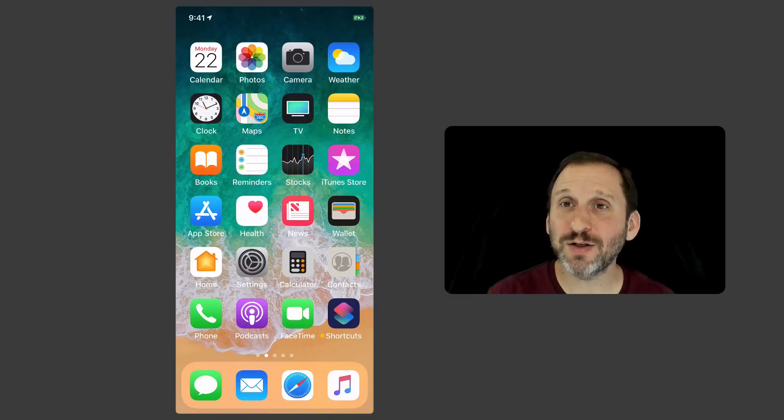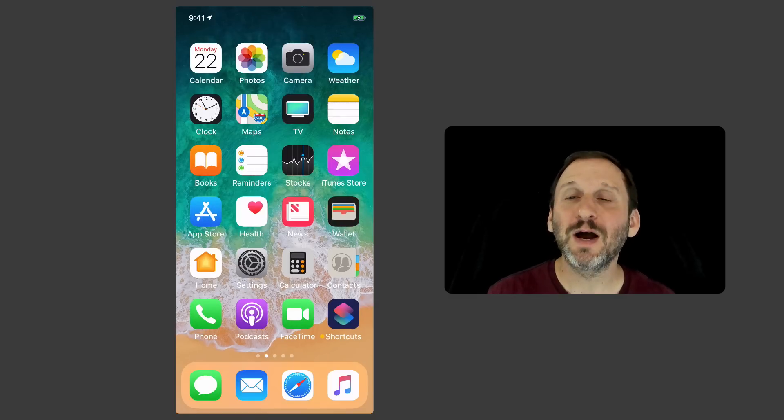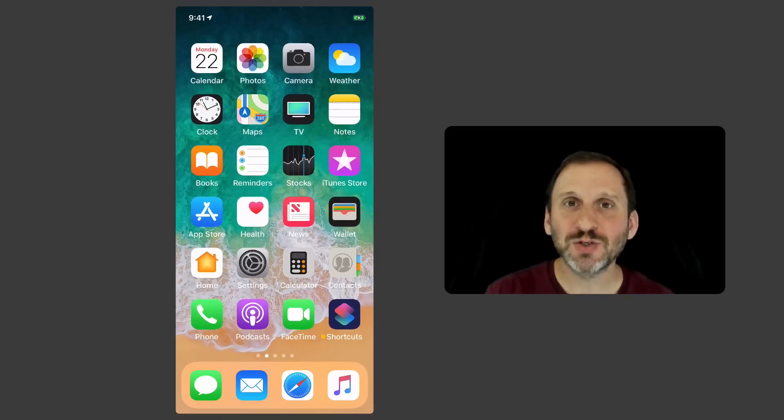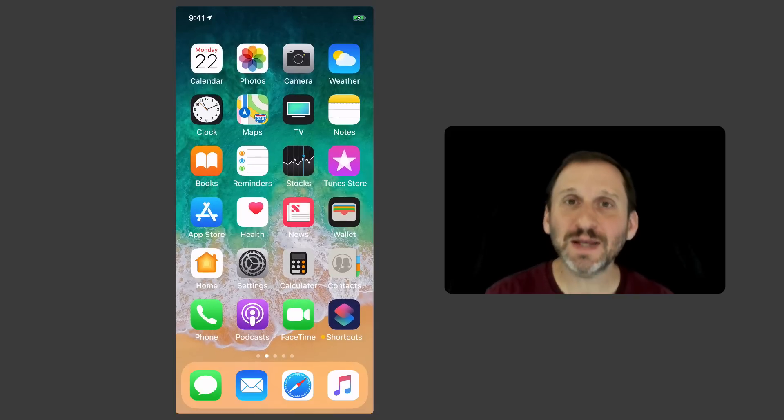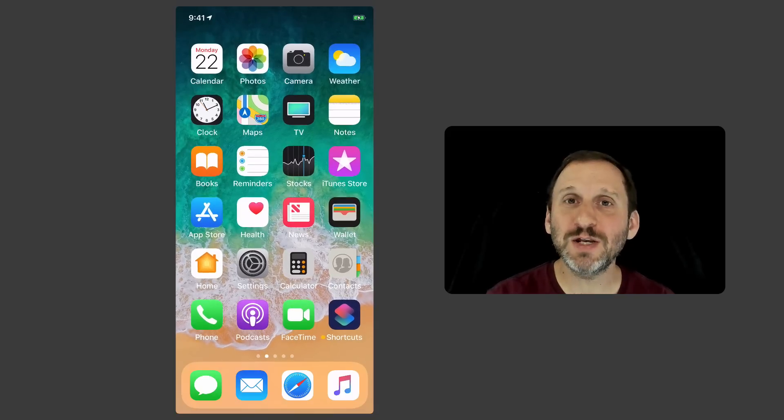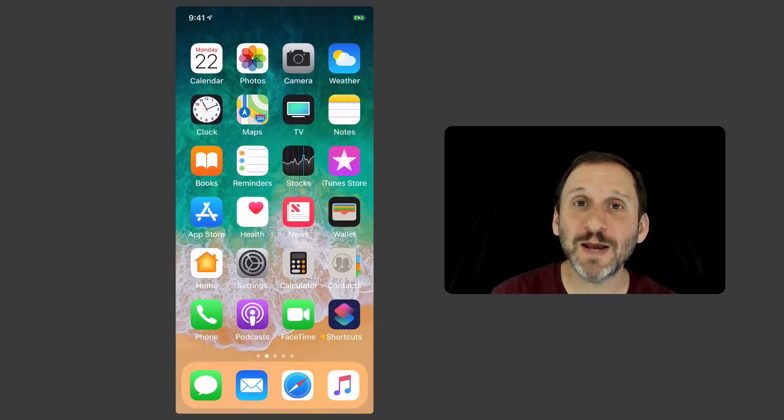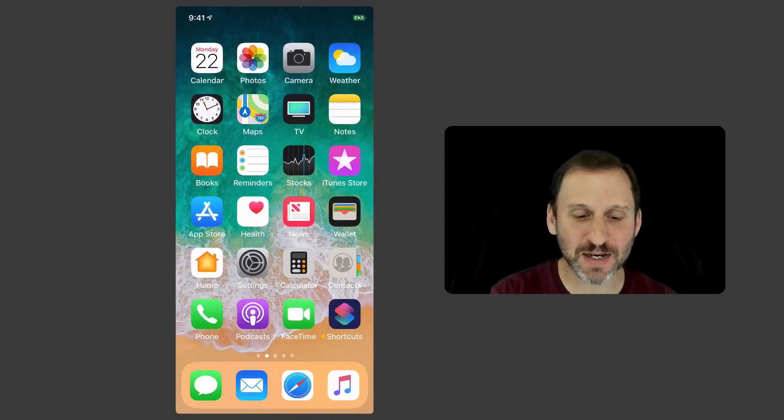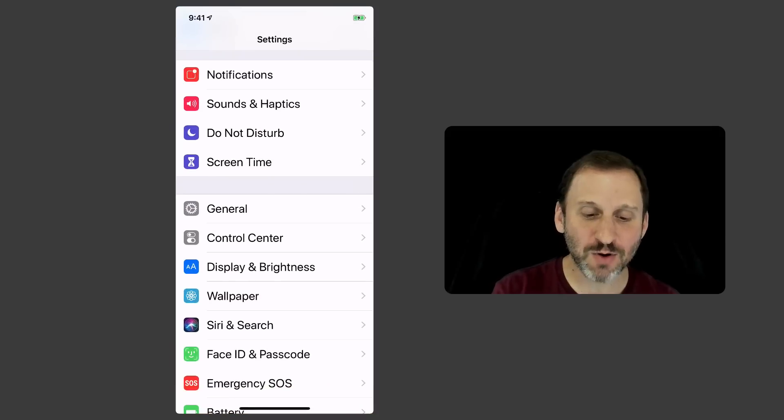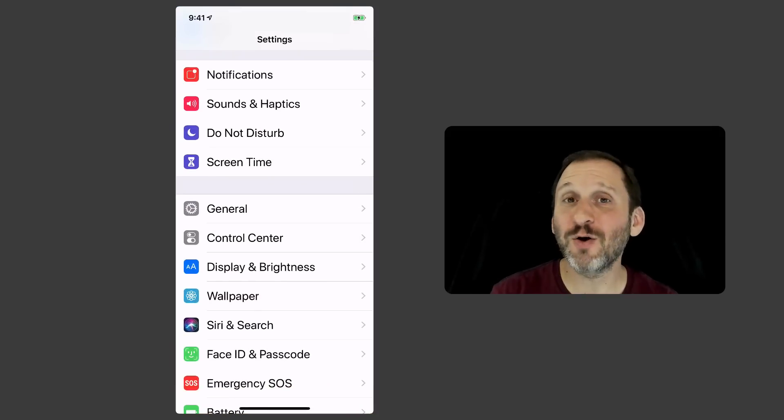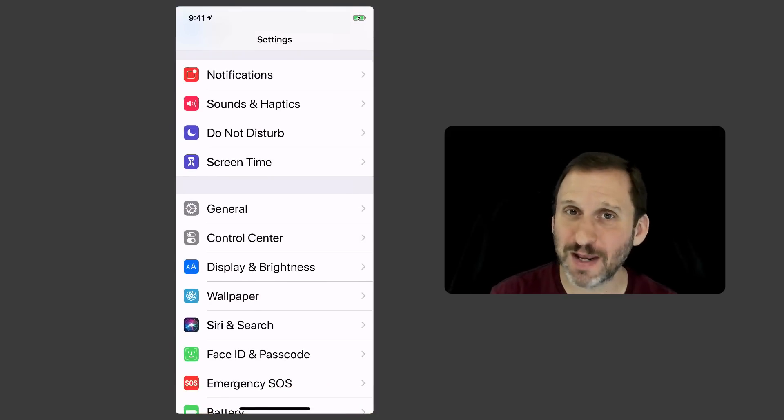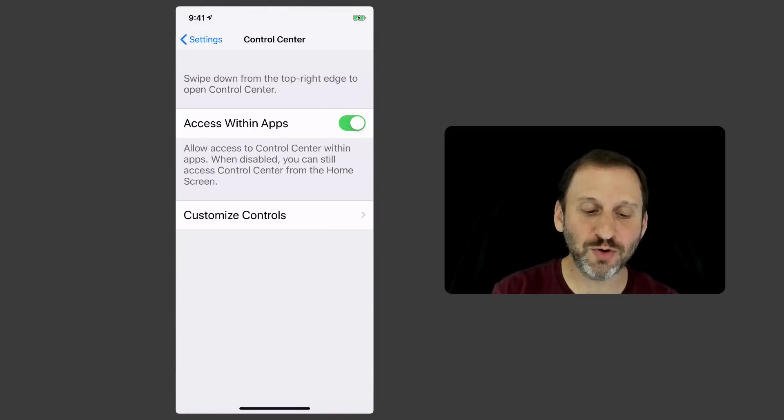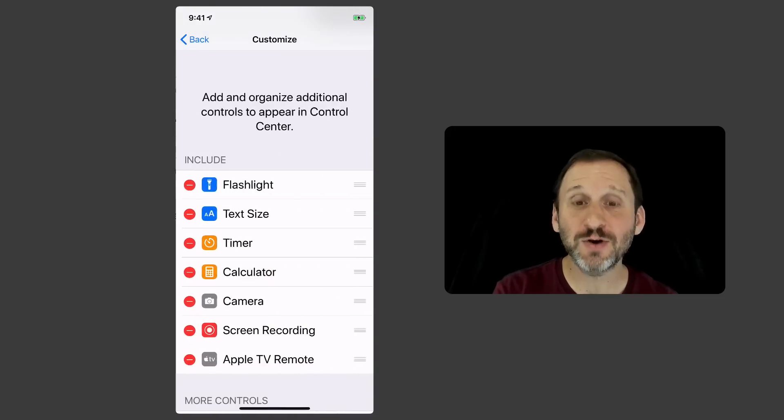Especially in a crowded situation where there's a lot of noise. Here's how to get it to work. First thing you need to do is enable it in your phone. It's not where you think it is. You think you go into Settings and then Accessibility but it's not actually there. It's under Control Center.